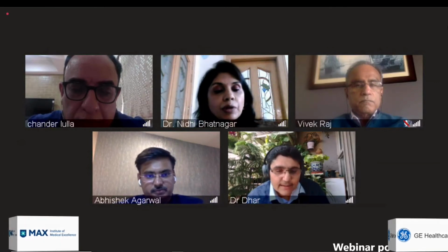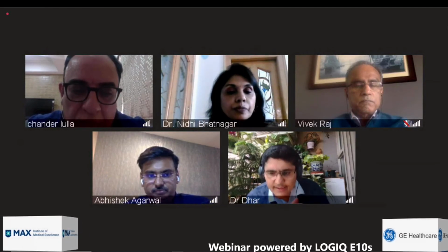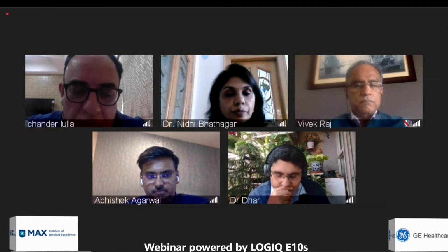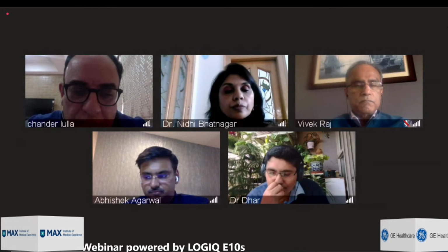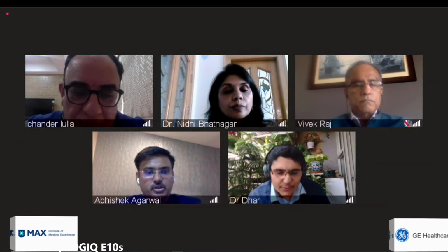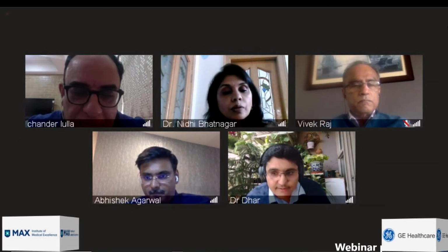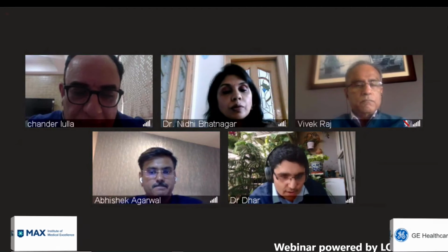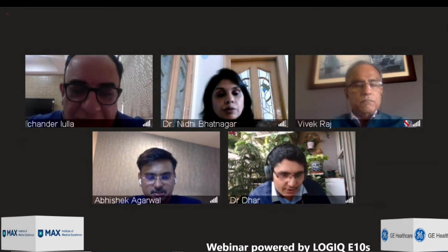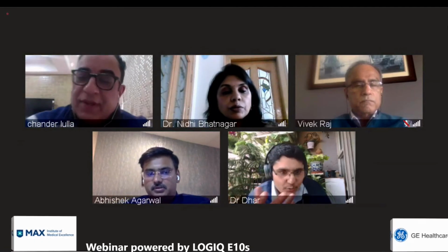Then there was another thing, Dr. Dhar. That's a very relevant point that Abhishek said, because practically, clinically, in a large ascites, you will not be able to find a window with no fluid. So let's be practical about it. Large ascites is a different scenario. But I completely understand what Abhishek says, that if it's an ultrasound, it's a sound wave, so it can even travel through the fluid. So maybe you can. Yeah, I think I buy that more.